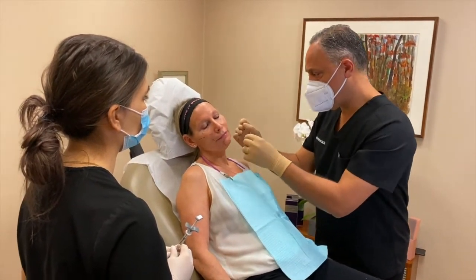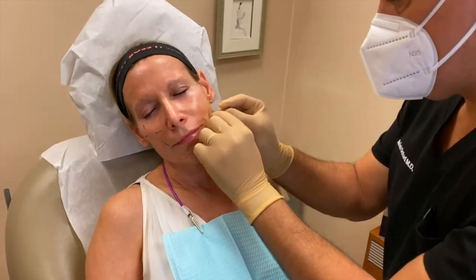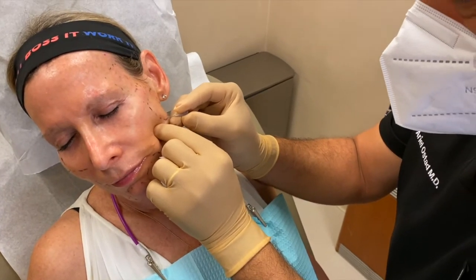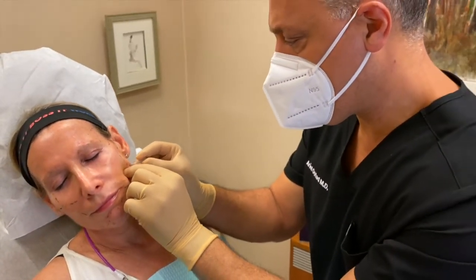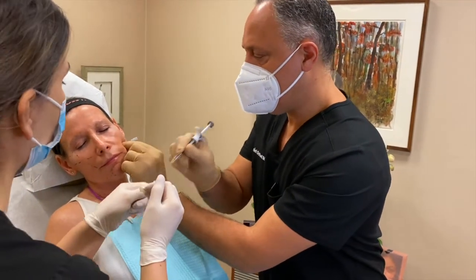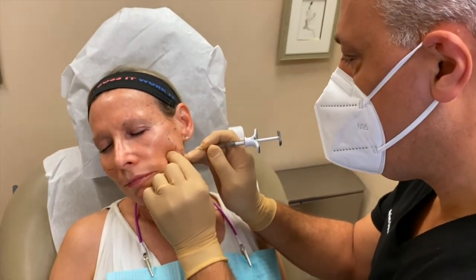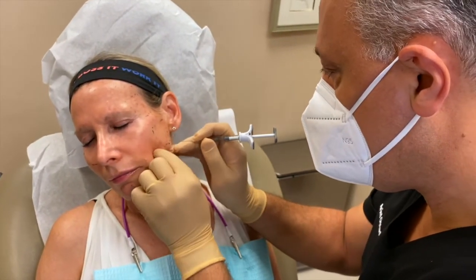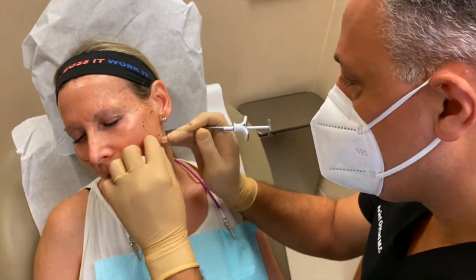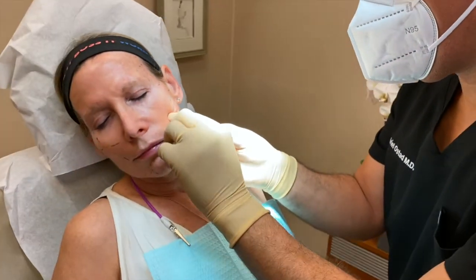Again, we're following the sterile technique. So you're going to feel a little pinch, okay? So we basically use a tiny little, what's called an introducer. Introducer is like a little tiny needle. So go ahead, Kat, and Kat's going to remove that. For this part, you can just bring the light over here for me. Okay, thank you.